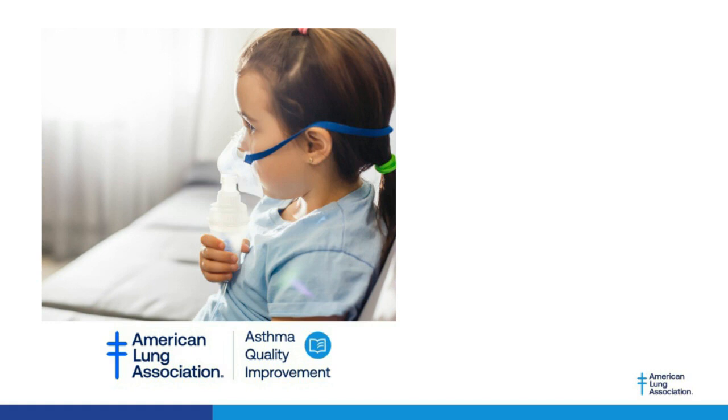Our healthcare systems and our infection prevention people and our pulmonologists who have been researching particulates, that's actually how we listed it. It wasn't from the CDC. I think it was an oversight. They did say something in the CDC statement, though, anything that could induce coughing, which, of course, spirometry can. So I guess loosely, spirometry is listed in the CDC, but not directly. Spirometry or pulmonary function testing is not.